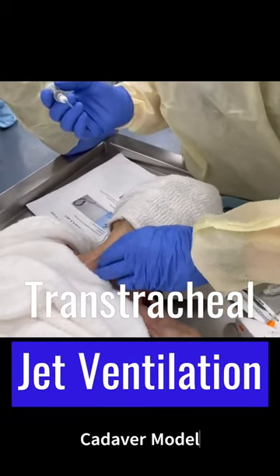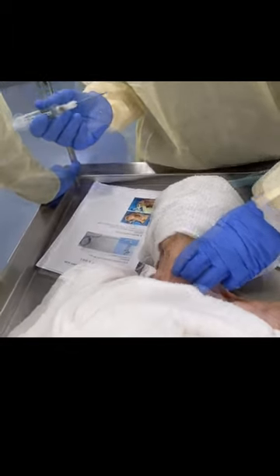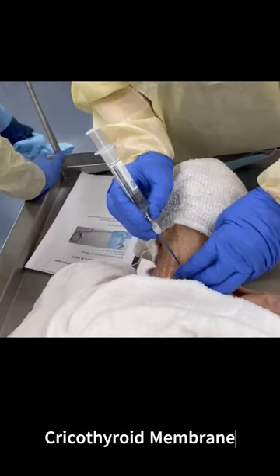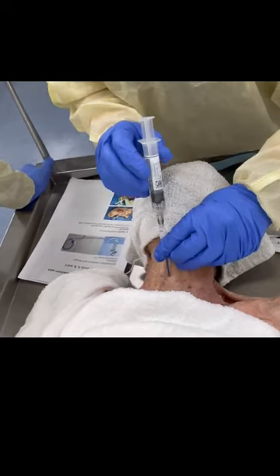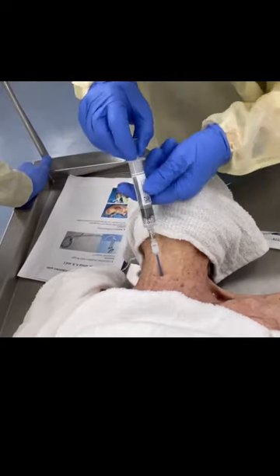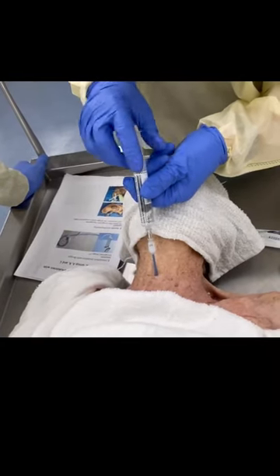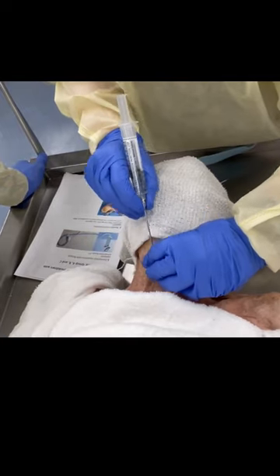I think here's my larynx. I have to assume it's right about here. So I'm going to go in with this. I'm going to aspirate. Okay, got air. Okay, so pull my needle out.